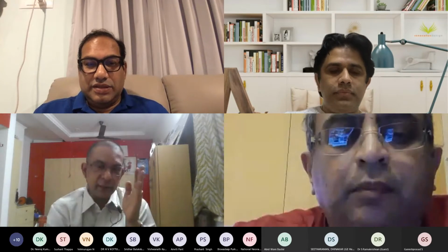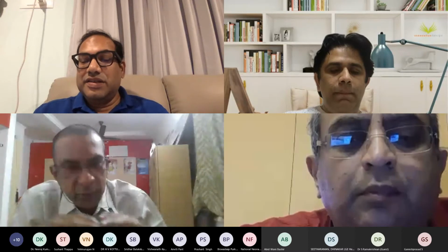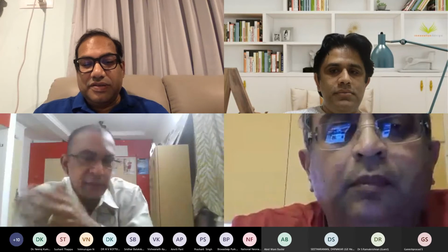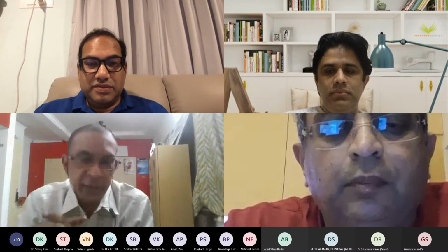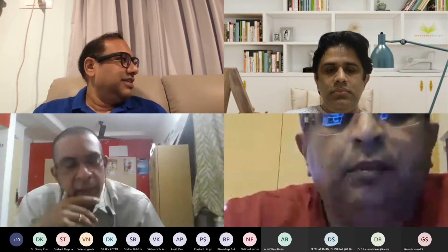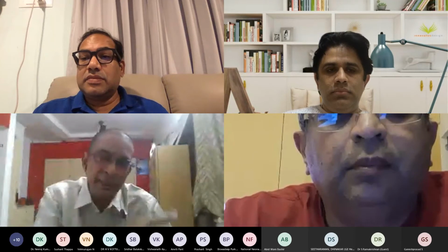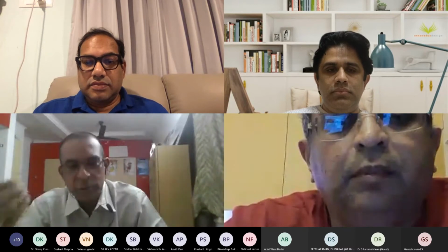Yeah, as you very clearly said, low acuity, mid acuity, and very high acuity. So we have various ranges. It's a big bouquet of flowers with different flowers. You pick and choose different monitors. The accessory compatibility between the ranges is very critical, and that is going to make or break it. Because if you really need to maintain 3 different inventories for low, mid, and high, then it becomes a very cumbersome process. So accessory compatibility, central station alignment, whether that full range can get into a single central station, the ease of use, the user interface, whether it is the same user interface for low, mid, and high, so that the staff nurses do not need much training. Those are fundamental things which we need to really see.